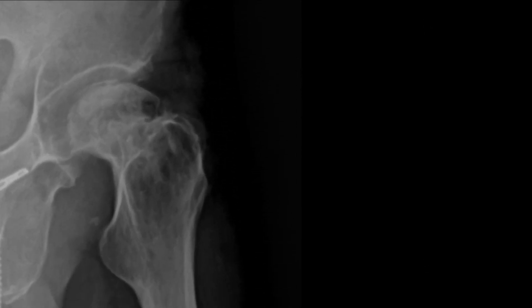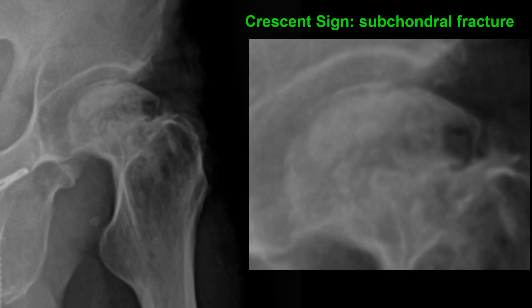Looking closely at the subarticular surface of the femoral head, you'll notice a thin curvilinear radiolucency. This represents the subchondral fracture and can be referred to as the crescent sign. When seen, it is highly indicative of avascular necrosis.